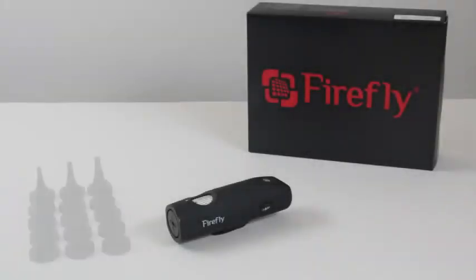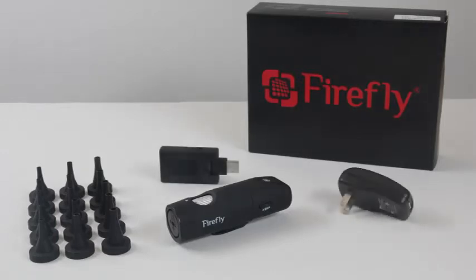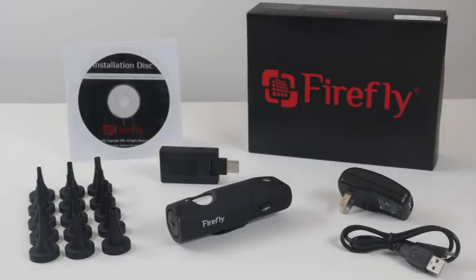Included with the DE550 are 3, 4, and 5 mm disposable specula, a USB wireless receiver, an AC adapter, a charging cable, Firefly Pro software, and a digital user guide.